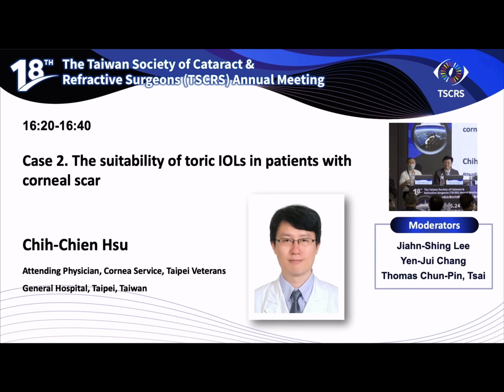Is there any hint that toric IOL can be used in RK patients? Because for this patient, it seems that this is irregular astigmatism, so it's not suitable for toric IOL. But is there any situation where we can still use toric IOL in RK patients?